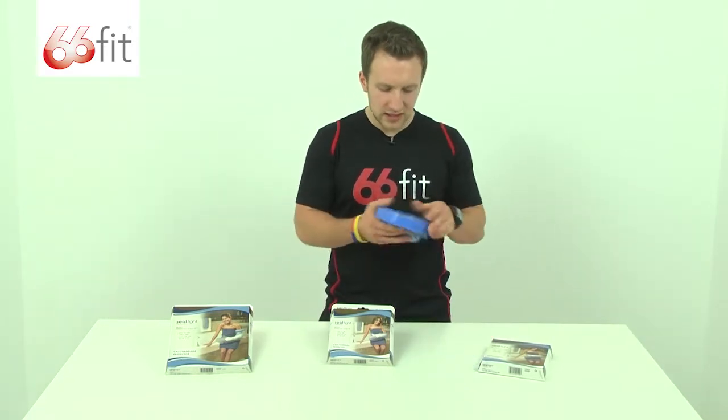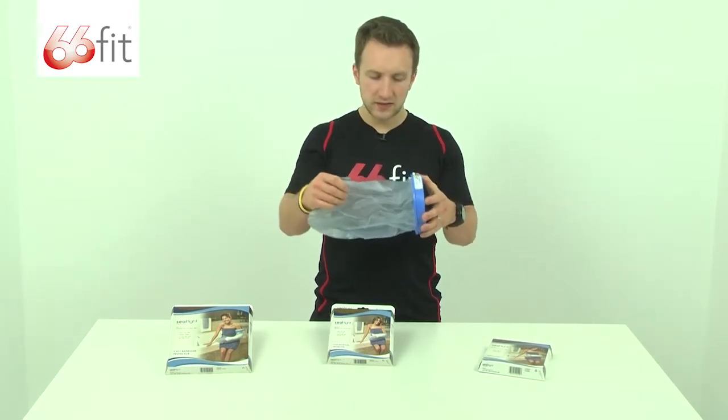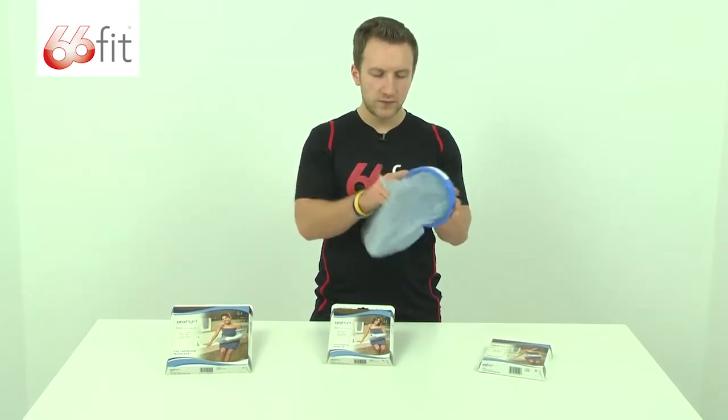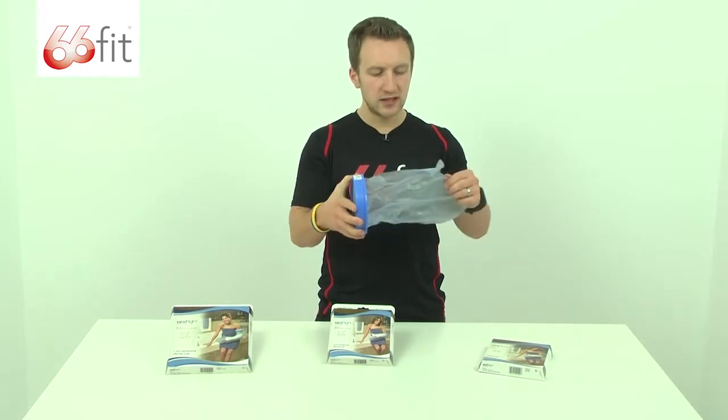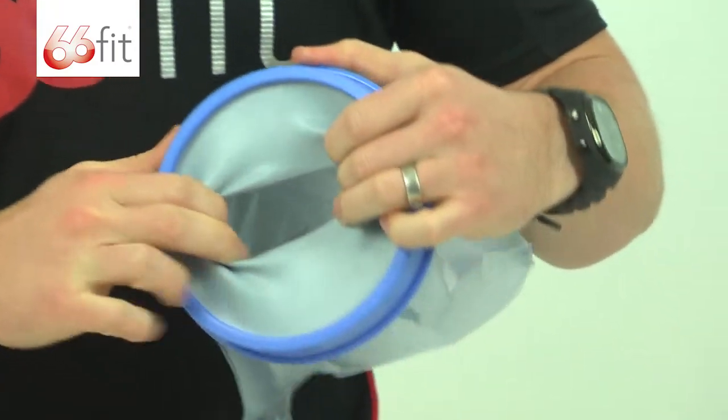These are really easy to use. You can see here, this one that I've got is for the hand — this is 12 inches long — and basically you would put your hand with your cast or your bandage inside here, through this rubber membrane.